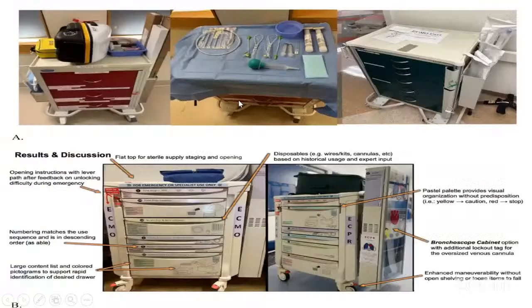Once you open it, the top of the trolley can be used for this. You can keep a sterile bed sheet on that, and you can keep the multiple things. You can keep the puncture needles, you can keep the dilators, and it can be used.